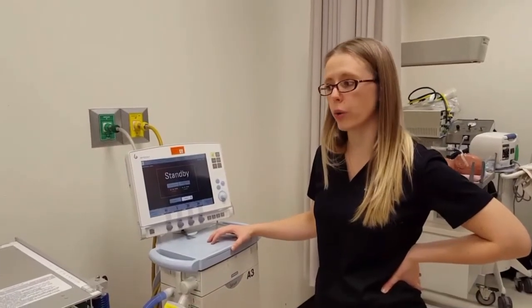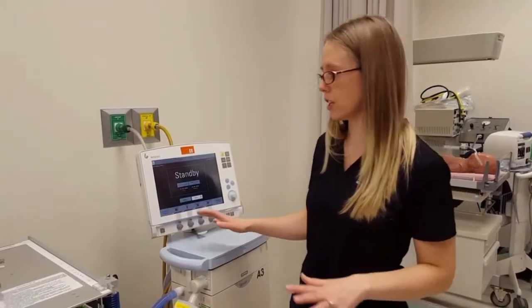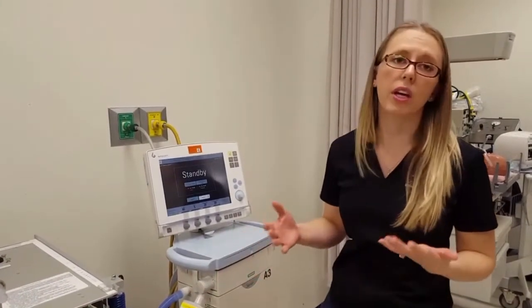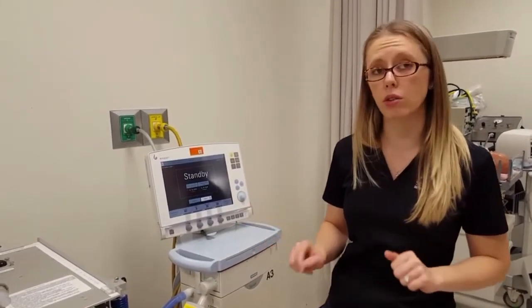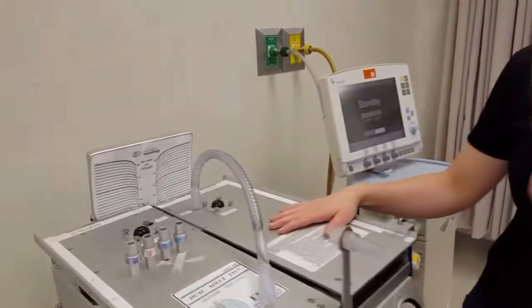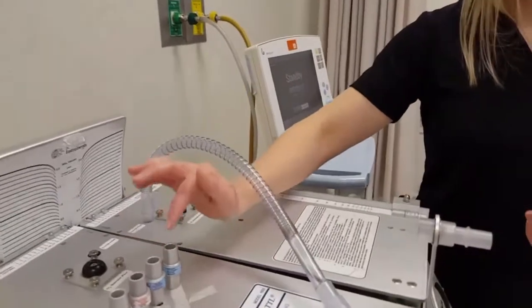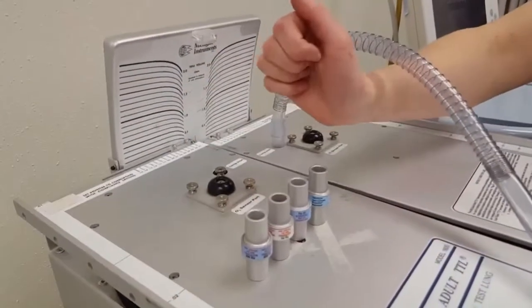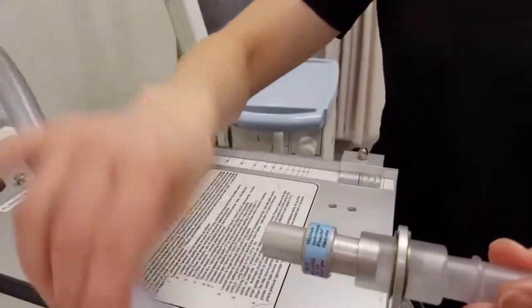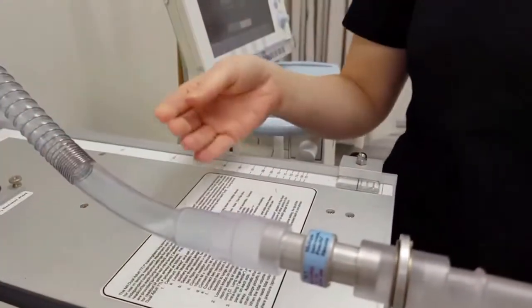Okay, so we're going to do our first patient on the Servo-I. This time it's just going to be a normal patient with normal compliance and normal resistance. So we're going to come over to our test lung and we're going to do our resistance. Remember we have 5, 20, 50, and 500. Normal will be 5. We're going to put that in line. And then we're just going to change our compliance.